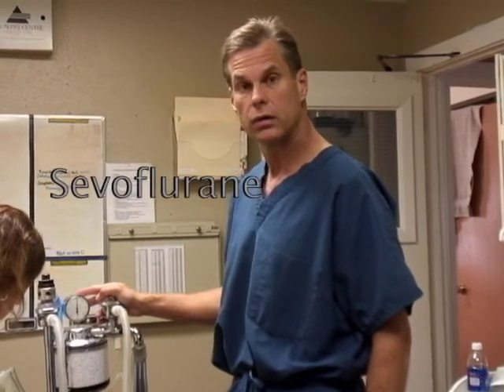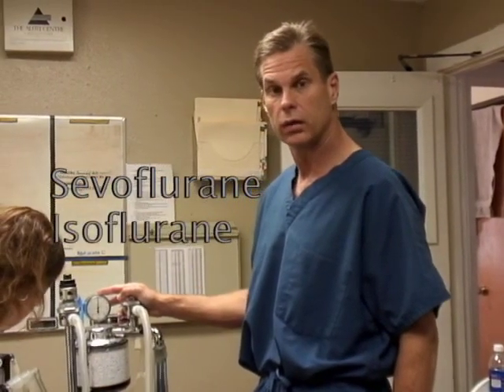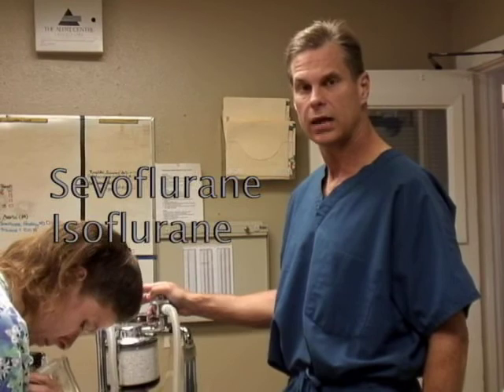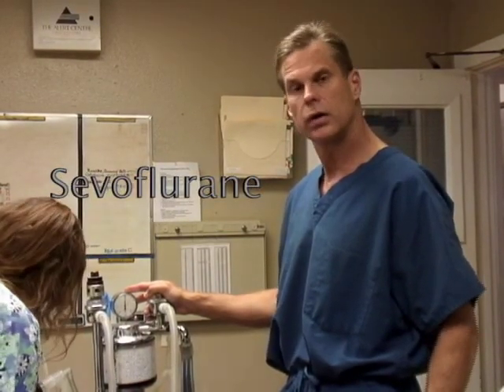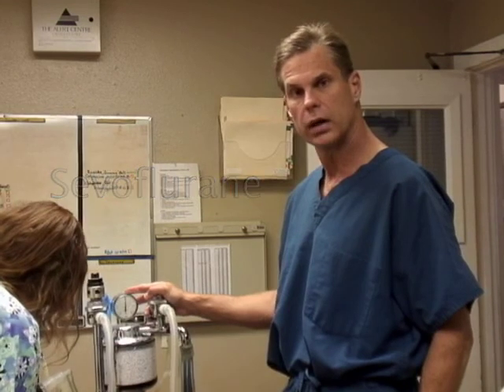Today we're using sevoflurane. At this clinic we use isoflurane and sevoflurane, and those are two very quick-acting gases that are good for sedating exotics. Sevoflurane is a little bit faster than isoflurane, so in this case we want him to recover as quickly as possible with minimal anesthetic hangover.